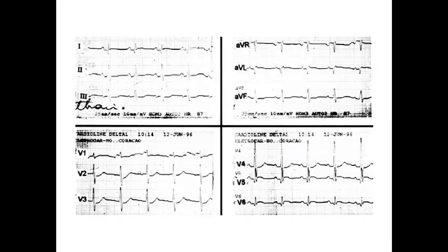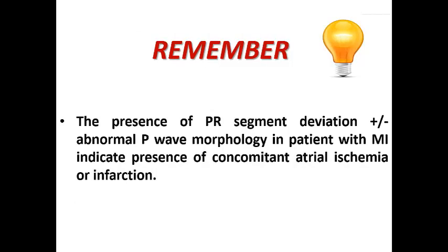Let's look at this ECG example. We can see PR segment depression in leads I, II, III, and V4, with reciprocal PR segment elevation in V1 and aVR — ECG criteria suggestive of atrial infarction. This is mostly right atrial infarction, and we'll explain why shortly. The presence of PR segment depression and elevation as reciprocal changes in a patient with MI — plus or minus abnormal P wave morphology — indicates concomitant atrial ischemia or infarction. Pay attention to these ECG criteria.